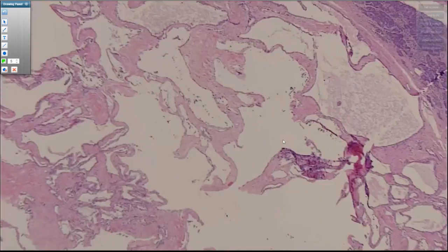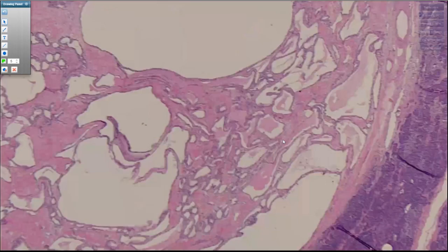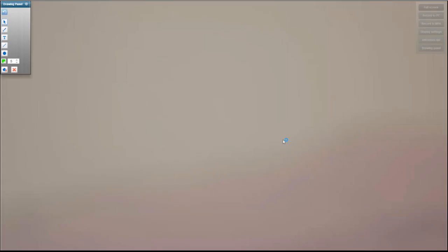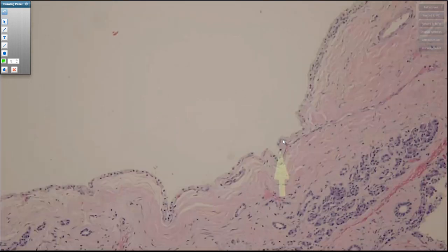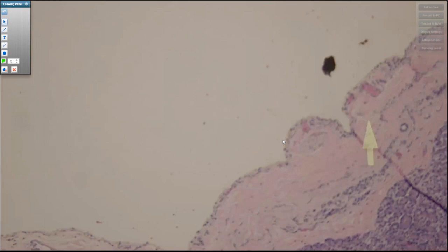Classic morphology is this microcystic appearance of multiply sized cystic spaces. I'll show you a couple of other variants. They can also be oligocystic, like this example here, where you essentially just have one central cystic cavity surrounded by your normal pancreas. And the lining from low power doesn't look like much. Then when we come up to higher power, you can see this pretty line of perfectly round nuclei, again with that nice clear, in this case almost dusky toned appearance to the cytoplasm. So this would be an example of an oligocystic serous cystadenoma.